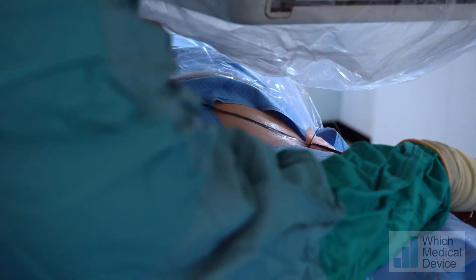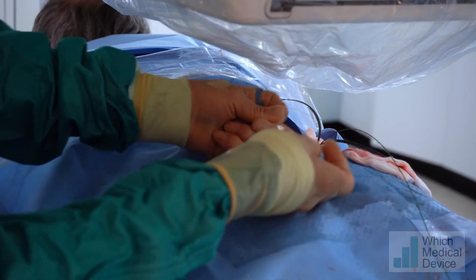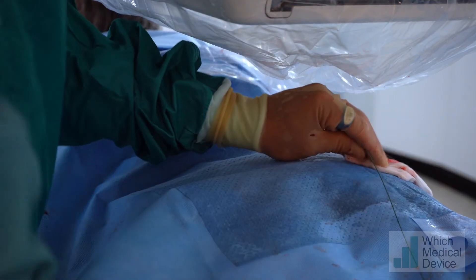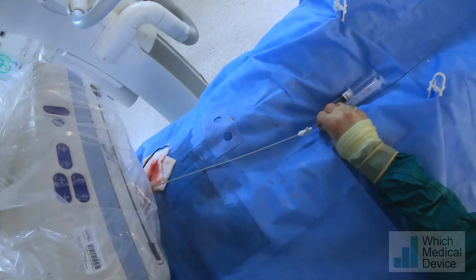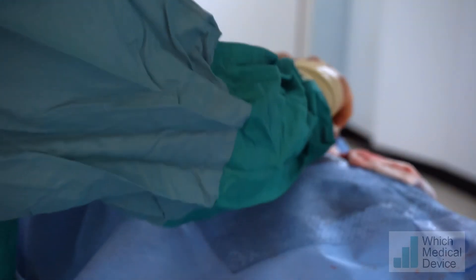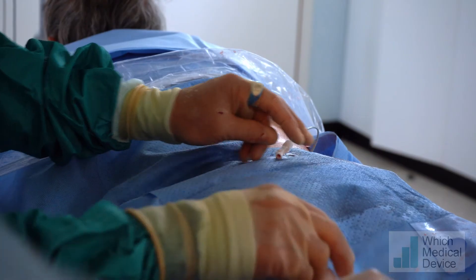Peeling the peel-away down to the level of the skin. Snapping the thread on the stent — finding where the knot is and pulling the side with the knot so we don't catch it in the stent. Thread is out. Now putting the nephrostomy on — this is a 7-French nephrostomy. We're going to leave this bunged because we don't need it on free drainage; this is purely in case the stents don't work. Nephrostomy's going in, wire's coming back, that's coiled up. Peeling the peel-away sheath away, keeping the nephrostomy in. Popping another bung on this side, then we're going to suture both nephrostomies in — they can be removed by traction on the ward once we're happy the stents are working.